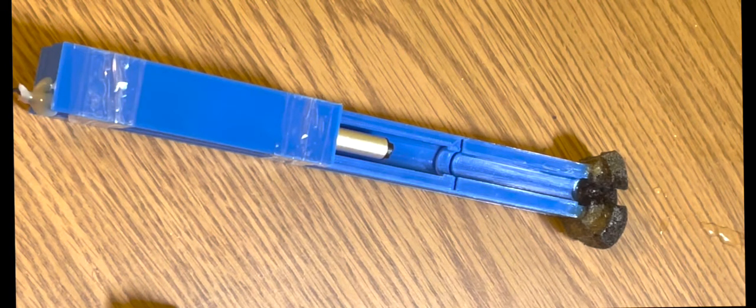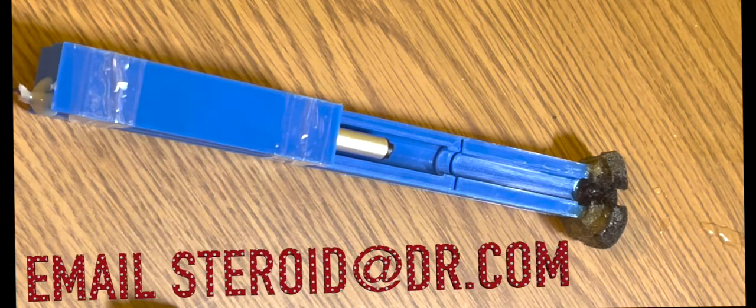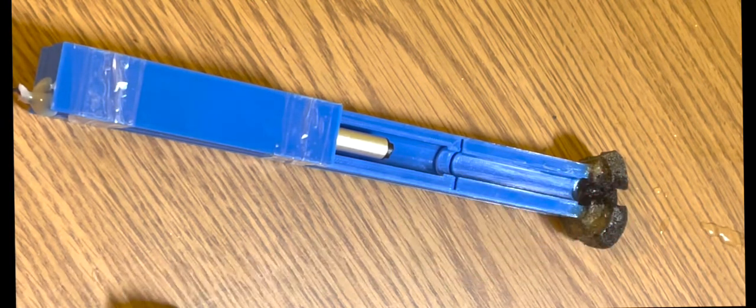This is the auto injector for people that may have dexterity problems. If you've ever tried to inject yourself with a thick substance, such as testosterone, you'll know that it's hard to hold the syringe and push on the plunger at the same time. It can be very difficult and you end up moving, which could be a problem.